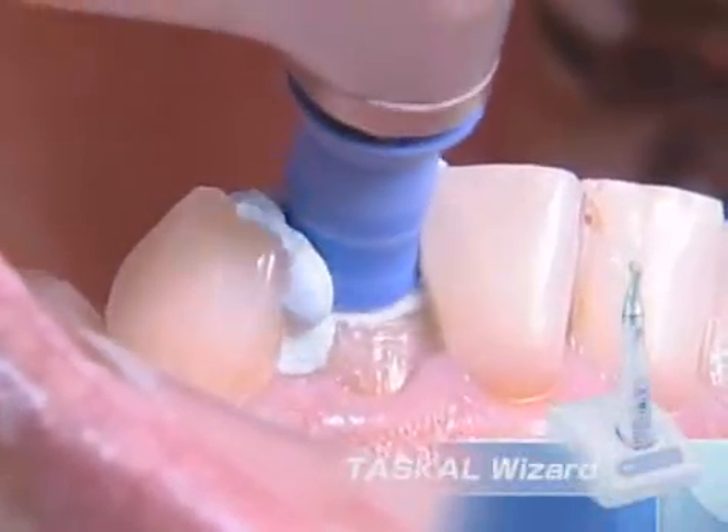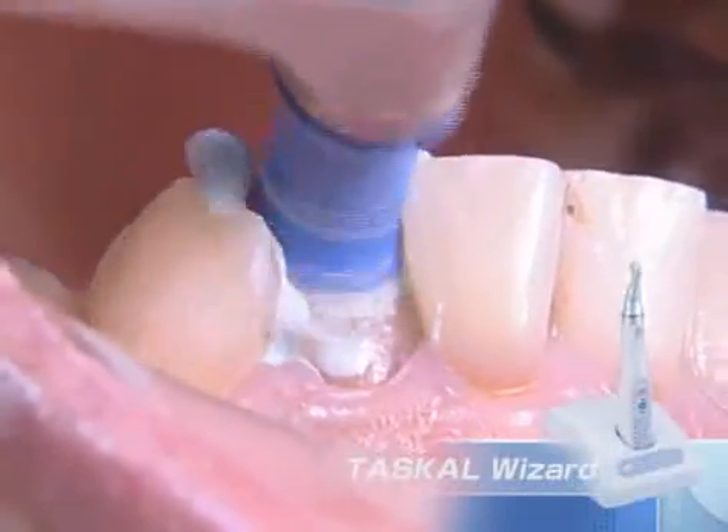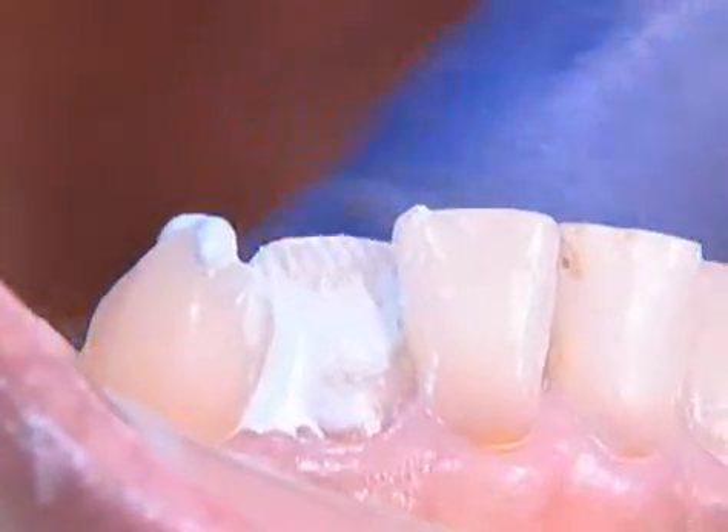Finally, the tooth surface is always polished. A prophy cup is attached to Taskal Wizard for polishing. The surface should be carefully polished with polishing paste. Fluoride-containing paste will help strengthen the tooth surface.